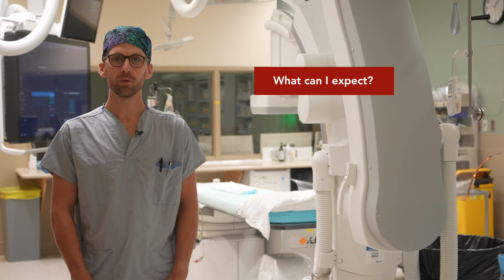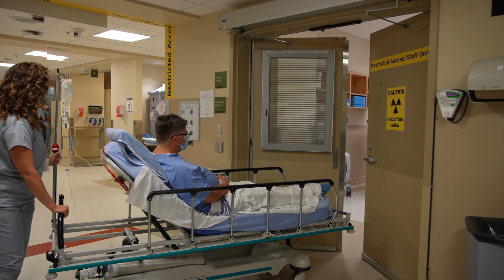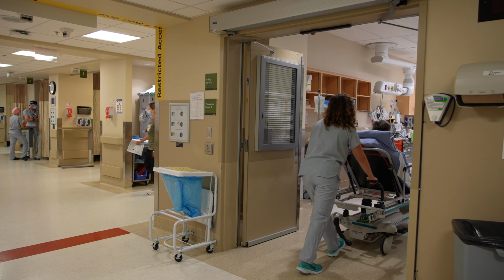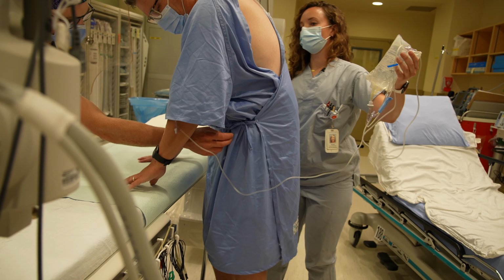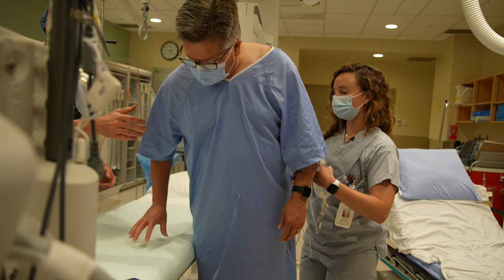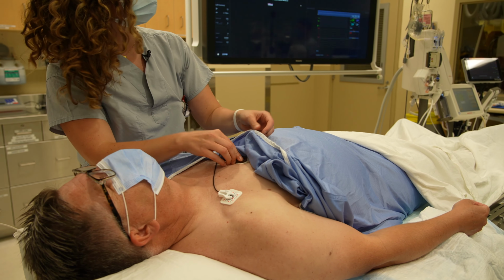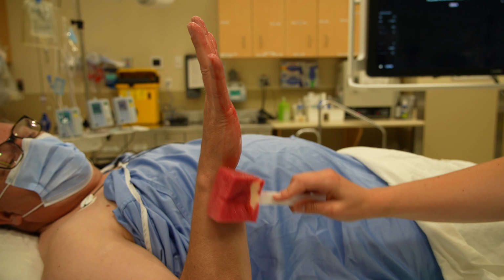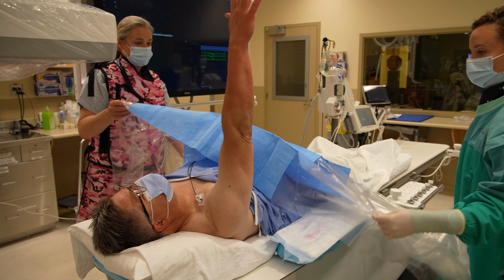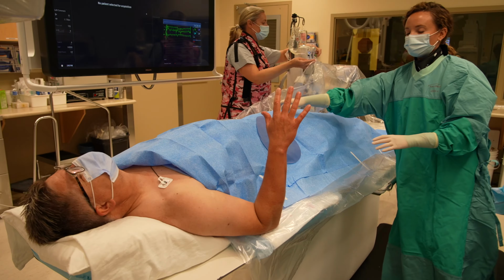During your procedure, you will be moved from the admitting area into the procedure room. This has the specialized X-ray equipment. Three or more nurses and a radiation or X-ray technologist will be present to help the cardiologist with the procedure. The cath lab staff will help you onto the narrow table where the procedure will be done. The staff will attach you to the heart monitor and to intravenous fluids. Your access site will be cleaned using a special cleaning solution before you are covered with a large sterile drape. This ensures no germs get into your puncture site.